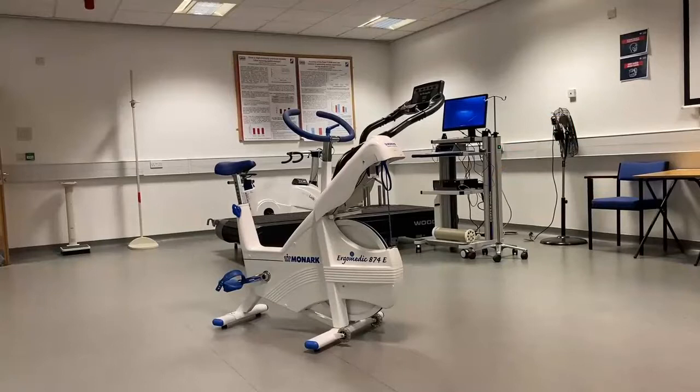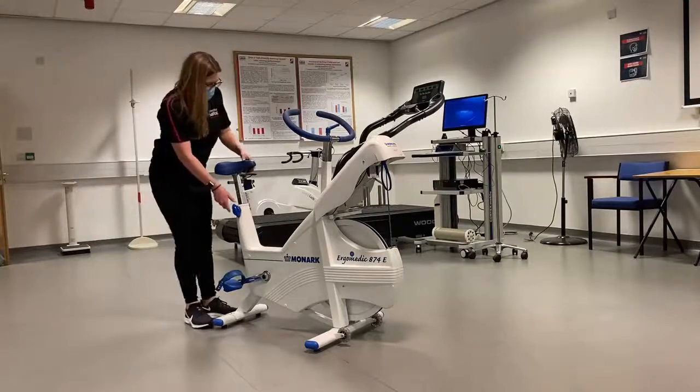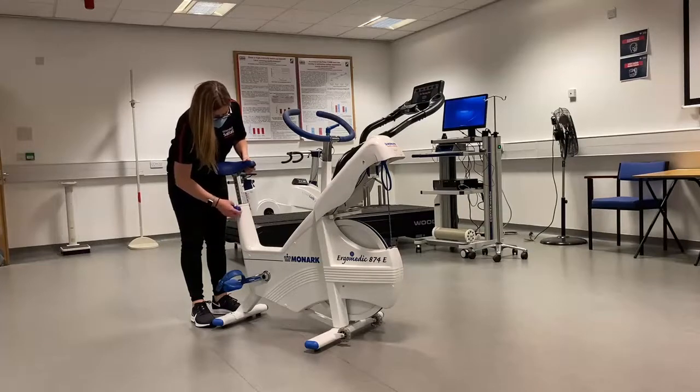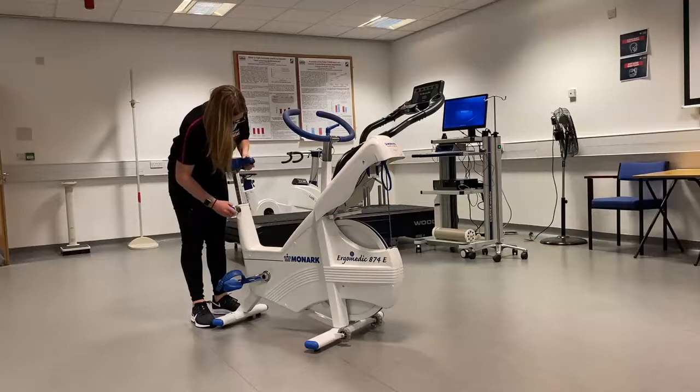When using the Monarch with a participant or athlete it is important to ensure that the bike is set up appropriately. You can see here how to adjust the seat height. Please note that the locking pin needs to be unscrewed all the way, and hold the seat with your other hand as once the locking pin is removed the seat will drop.